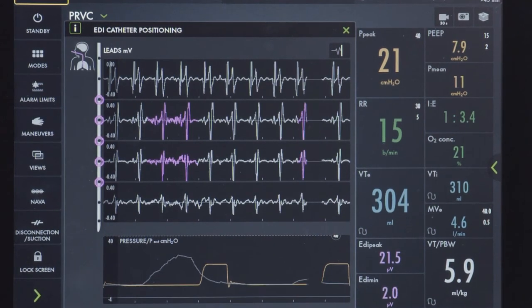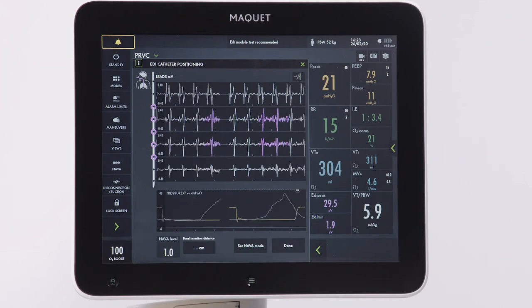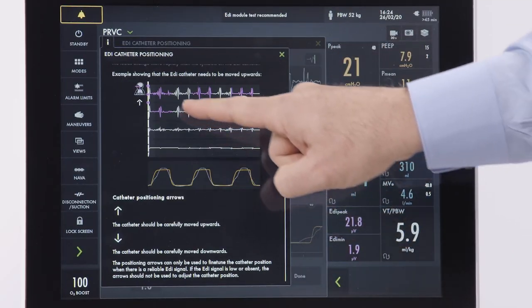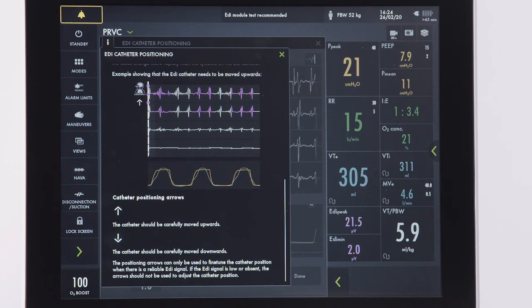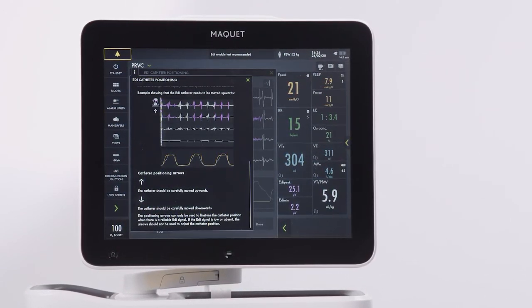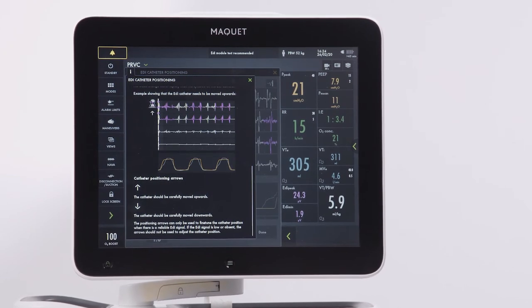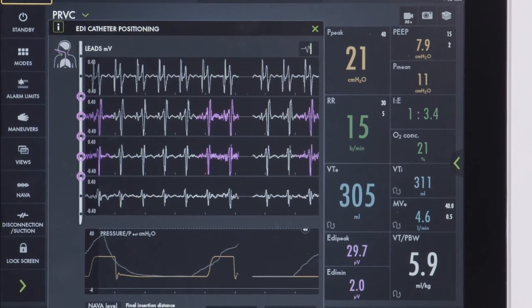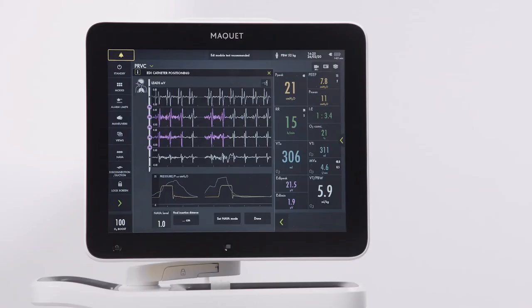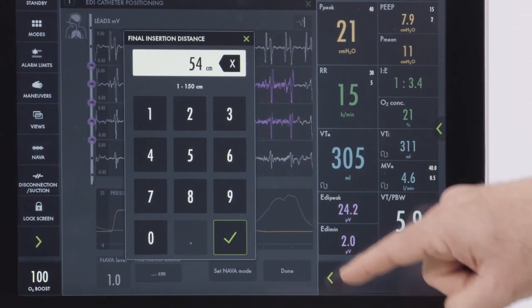If no EDI signal is detected, there will not be any indications. The positioning arrows can only be used to fine-tune the catheter position and guide which way to move the catheter — either up or down — when there is a reliable EDI signal. If the EDI signal is low or absent, the arrows should not be used to adjust catheter position. If the upper leads are highlighted, gently pull out the EDI catheter until the pink highlights appear in the center. If the lower leads are highlighted, insert the EDI catheter further until the pink highlights appear in the center. The pressure waveform in yellow and the pressure estimated waveform in gray are located at the bottom of the screen. The final insertion distance can be entered here and it will have a date stamp.